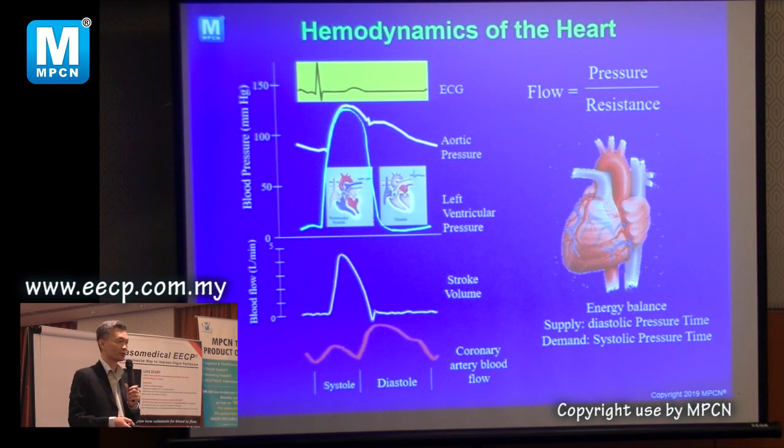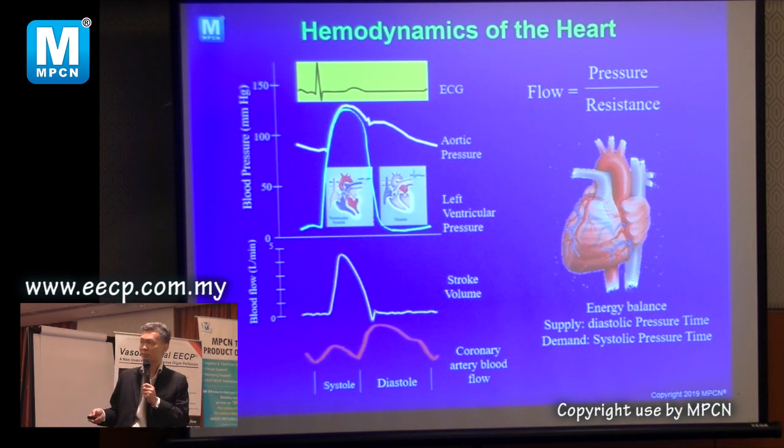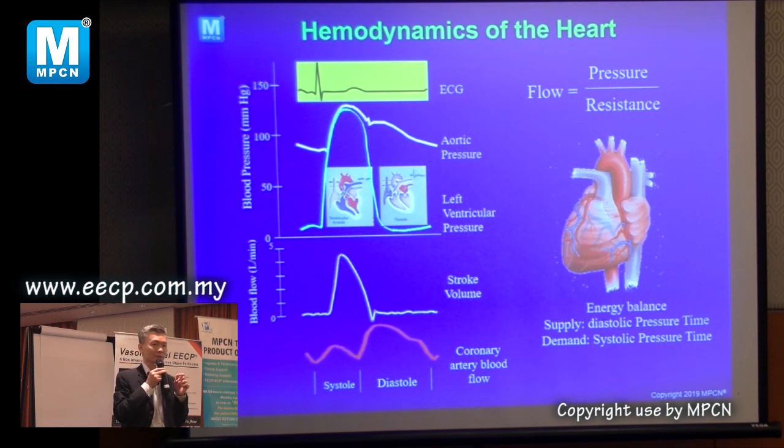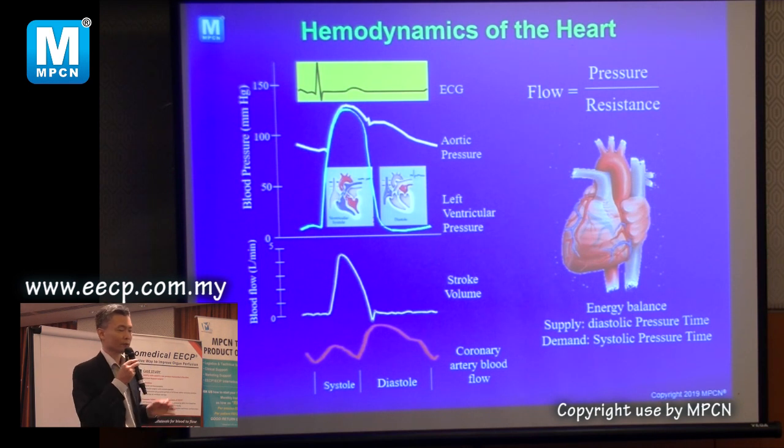This is also an important principle because some patients have an irregular rhythm called AF. It's not regular. When it's irregular and they also have this small little spike, the machine becomes confused whether the heart is contracting or not contracting. Is it important to know? Yeah.